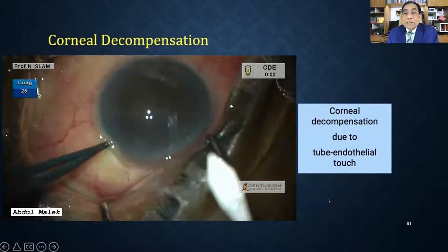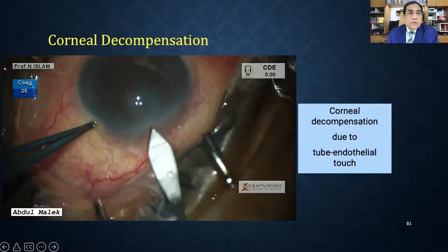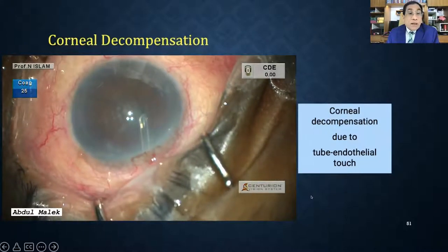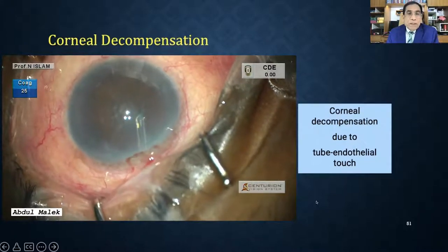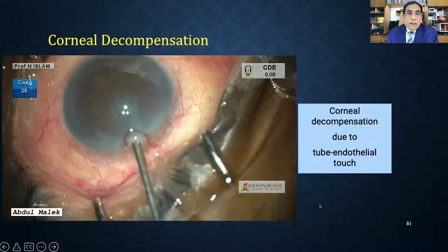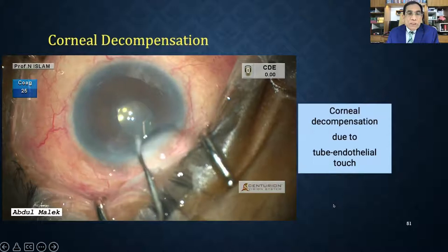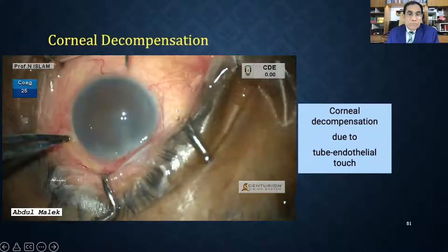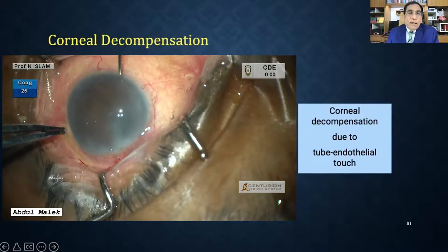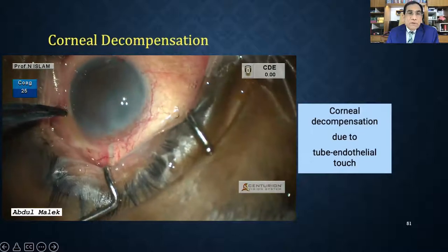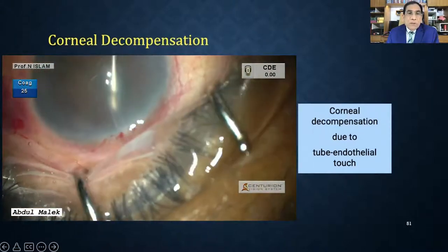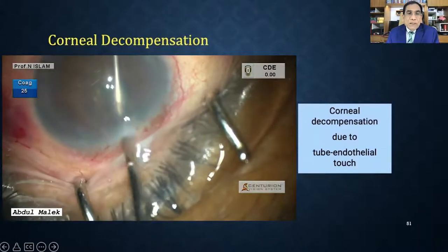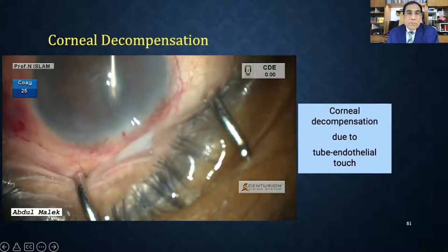Corneal decompensation occurs when the tube is too long and touching the cornea. In this case, cut the tube short if possible. If that doesn't resolve it, change the tube position to the sulcus. Using micro-forceps to hold the tube end, cut it to appropriate length and extract it carefully.